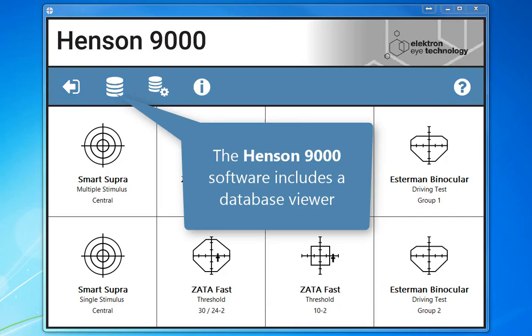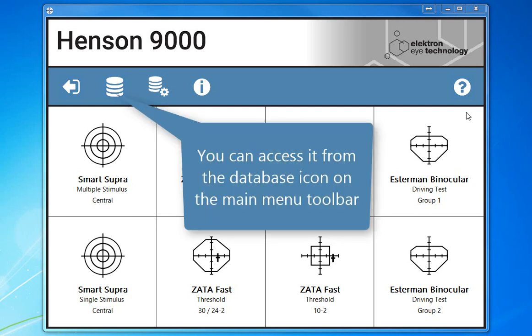The Henson 9000 software includes a database viewer. You can access it from this icon on the main menu toolbar.